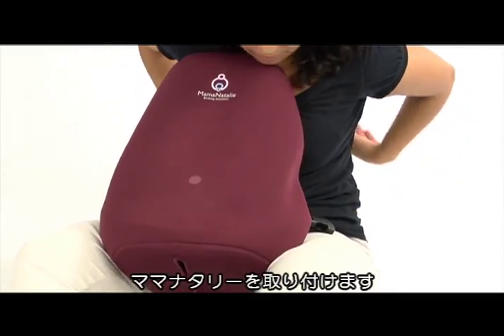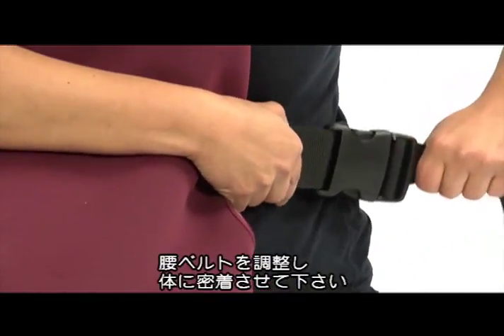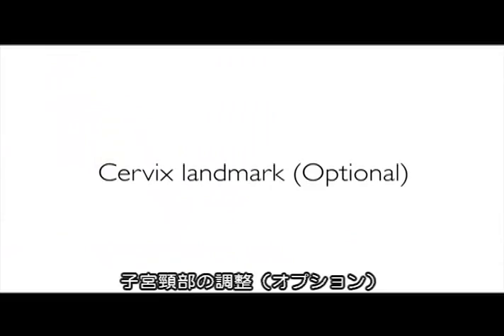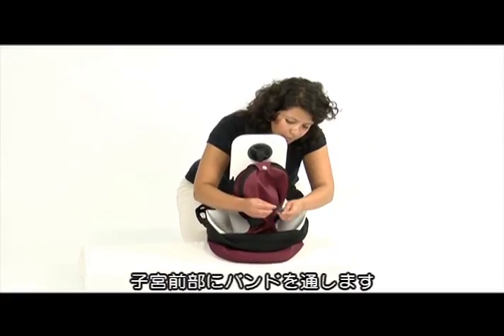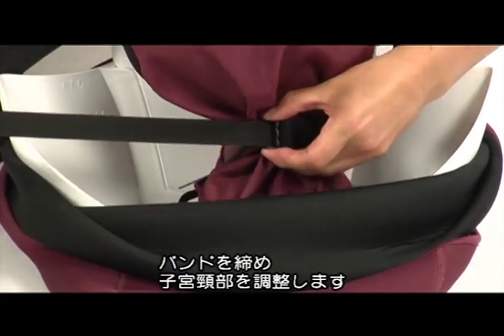Strap Mama Natalie around your waist. Adjust the belt so that the simulator is secure and snug against your body. Pass the cervix ribbon through the holders in front of the uterus and tighten the cervix band to the desired level.